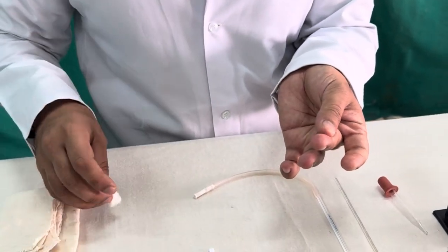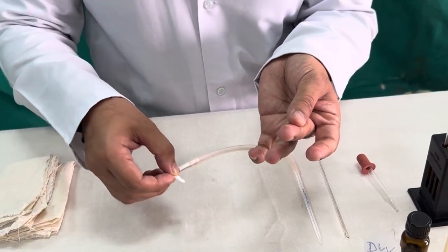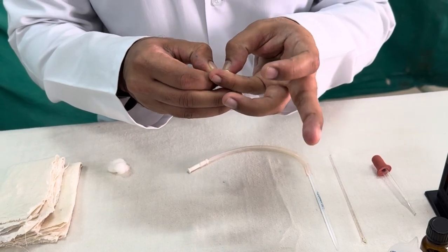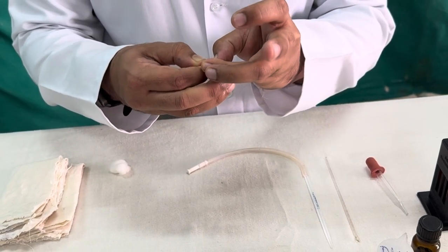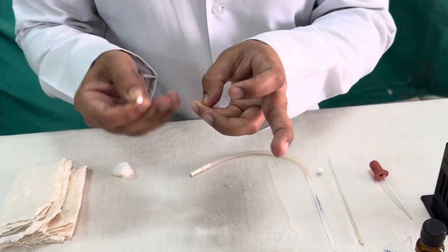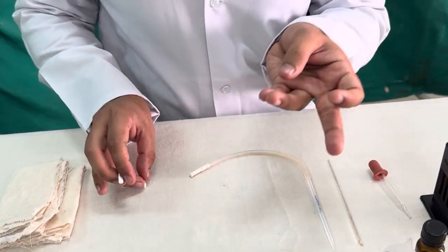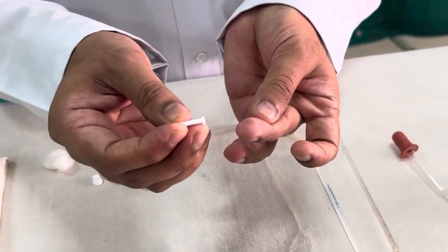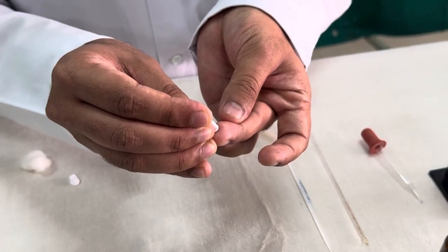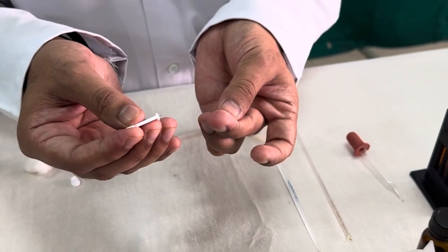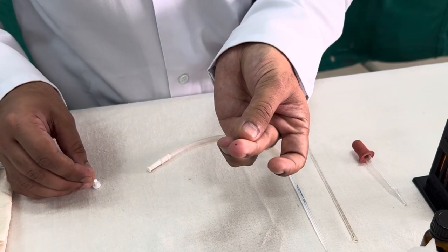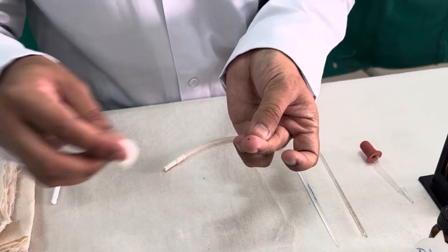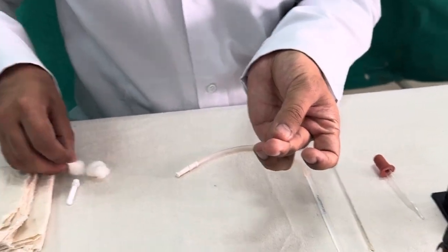Then by using a sterile lancet with one stroke - this is the most important part where students will find very much difficulty, but once you practice these things it will be easy for you. So with one firm stroke you have to prick the tip of the finger like this. After that a drop of blood will come. So first few drops, actually one or two drops, you need to discard it because mainly it is tissue fluid.